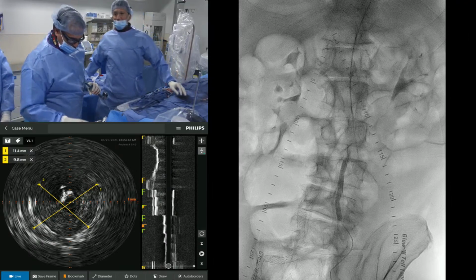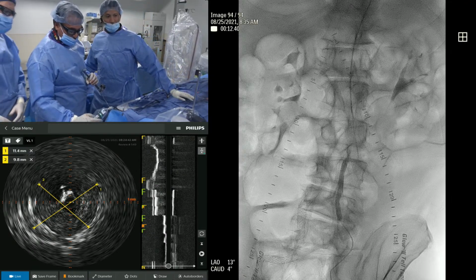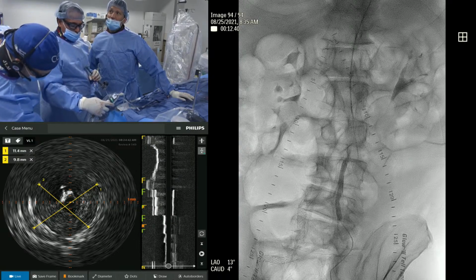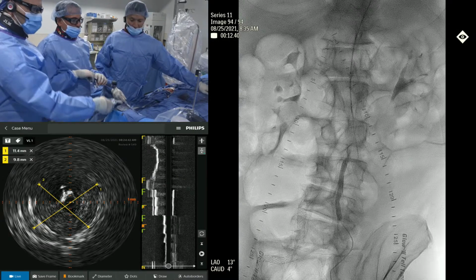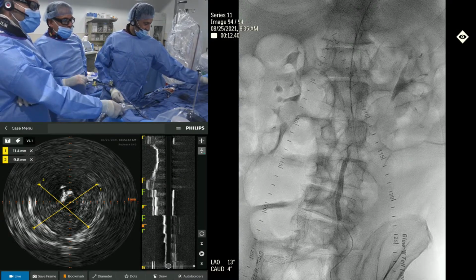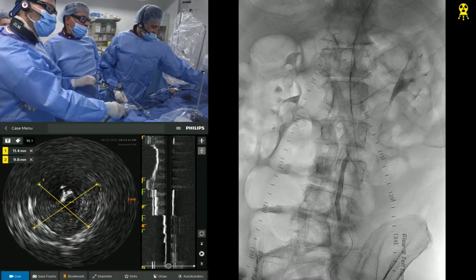And now we're going to go up with the shockwave. Ready? Save that image, Luke. Go ahead. So Luke's going to teach me how to do it. So we're going to press the shockwave. And you can see here it's starting to expand slowly but surely.